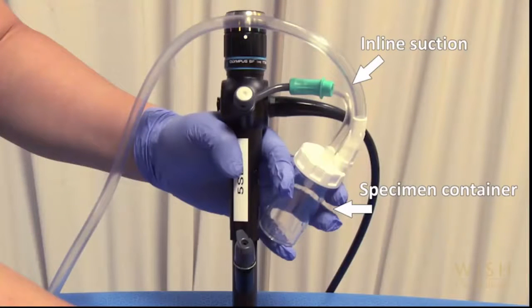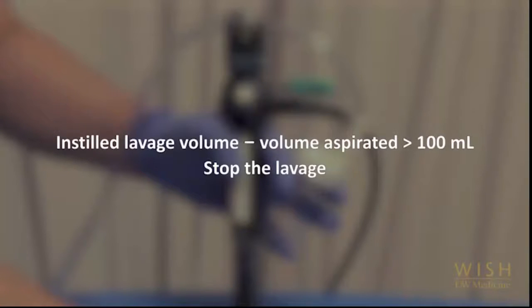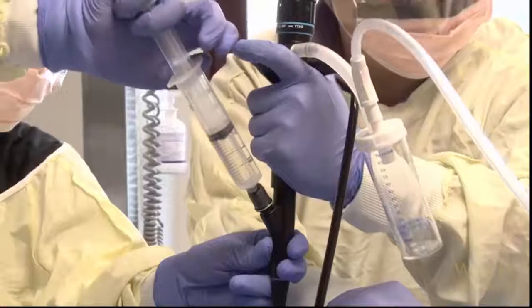Next, a sterile specimen container, commonly referred to as a Lukens trap, is attached in line with the suction tubing to the bronchoscope. The lavage fluid is retrieved by suctioning through the bronchoscope into the specimen container. If the difference between the instilled lavage volume and the volume aspirated is greater than 100 milliliters, it is preferable to stop lavage in that particular segment.